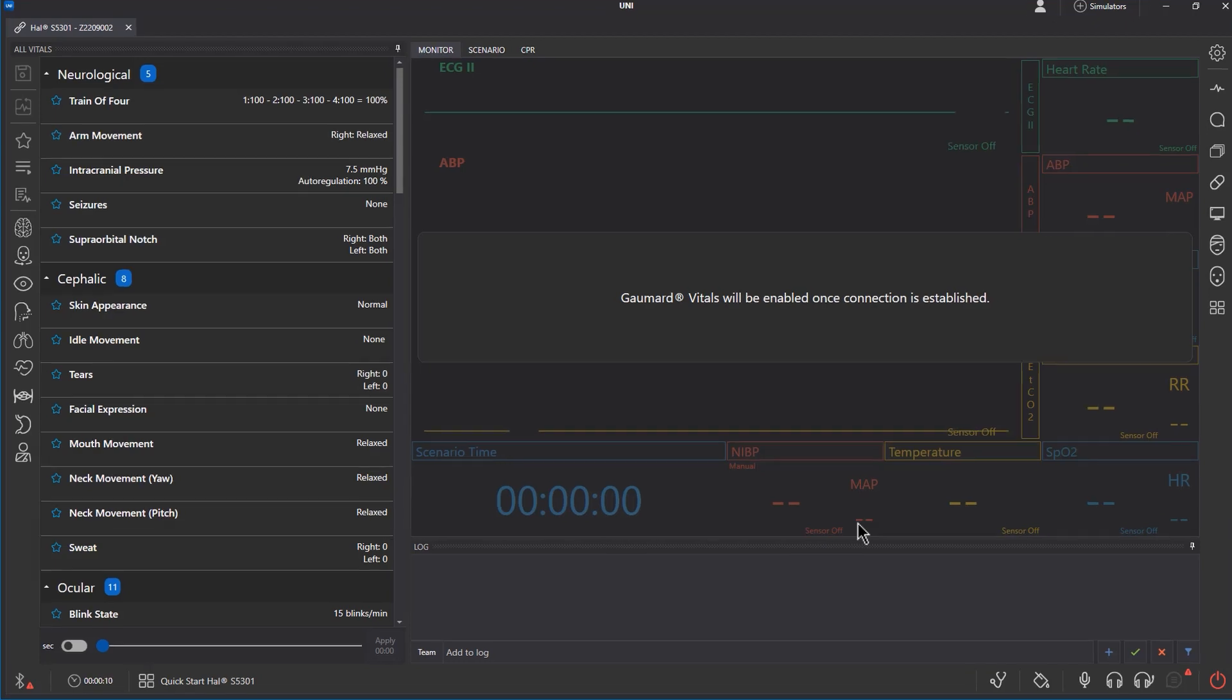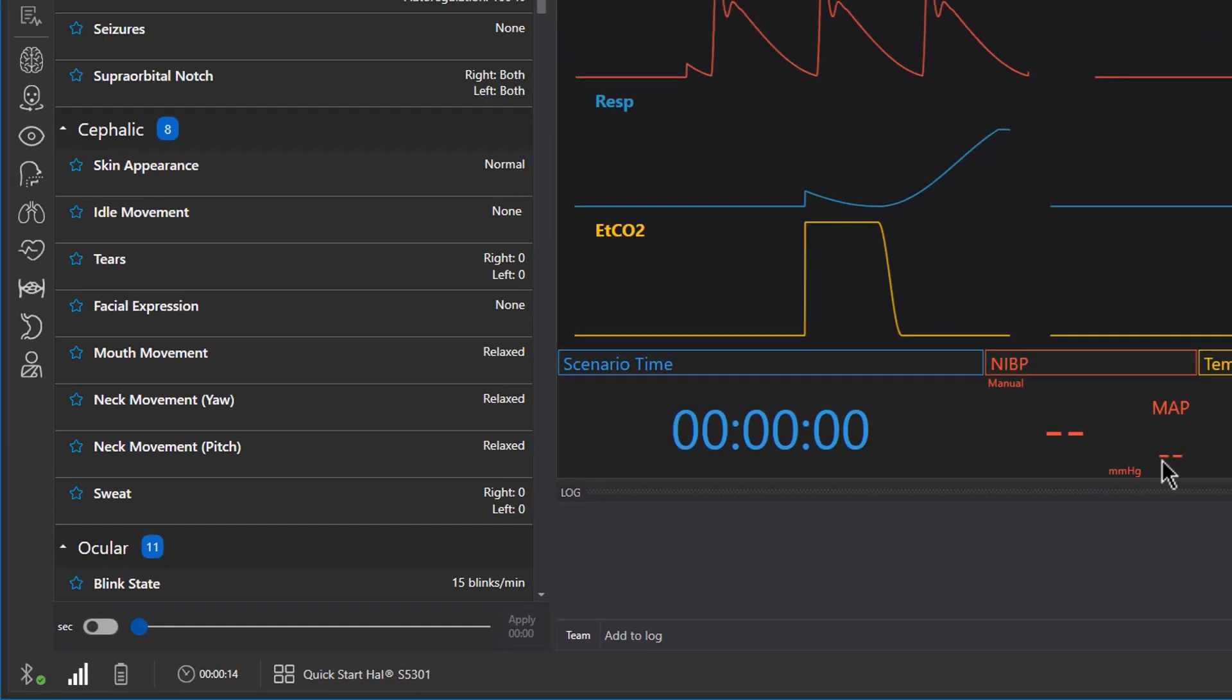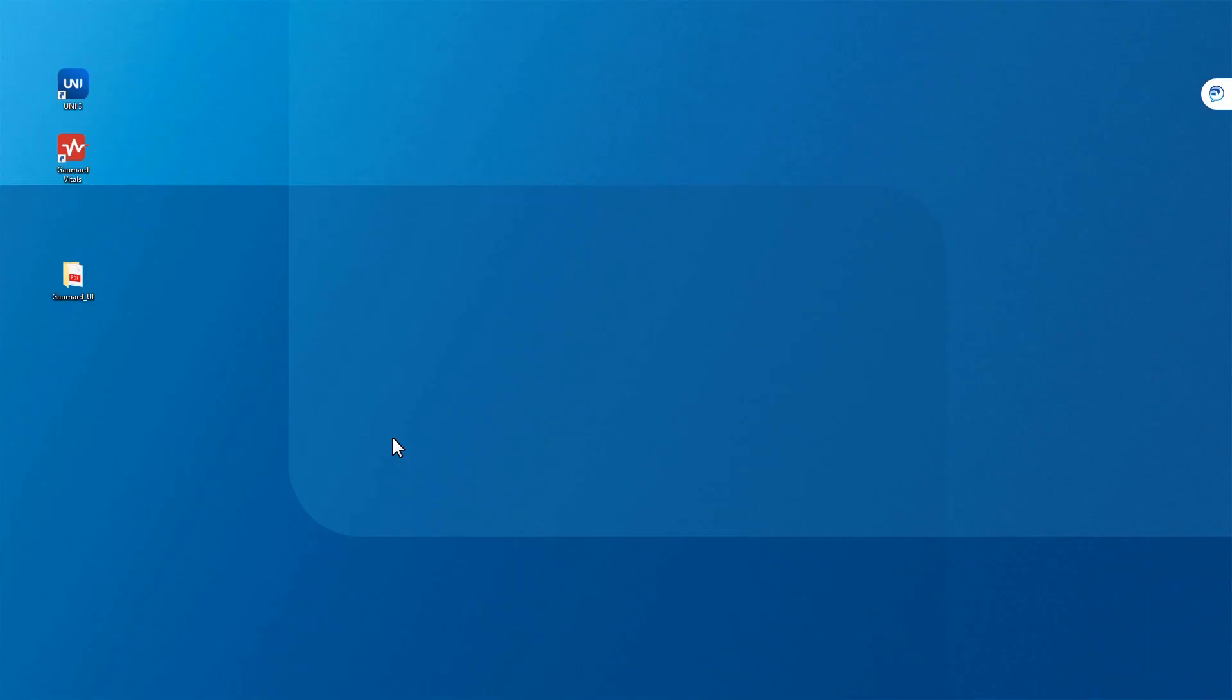When successfully connected, the icon in the bottom left will show the strength of your connection.